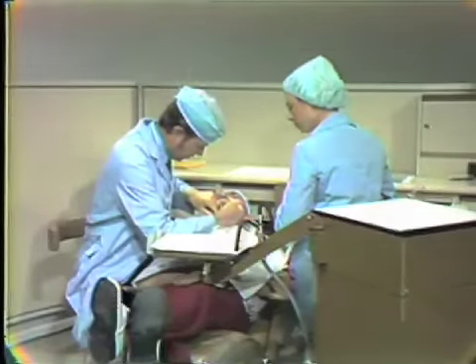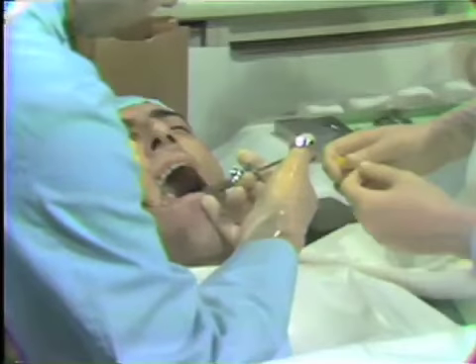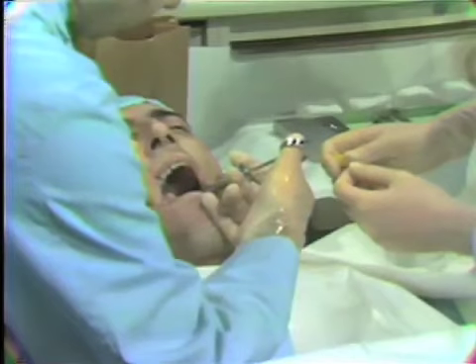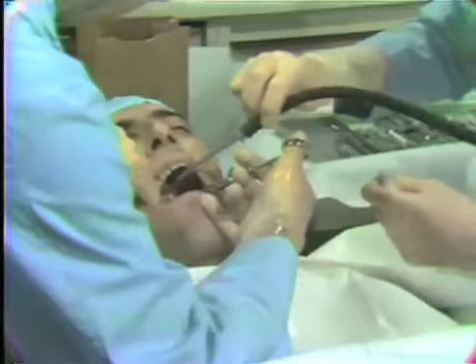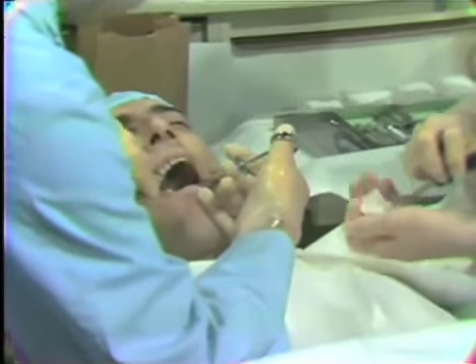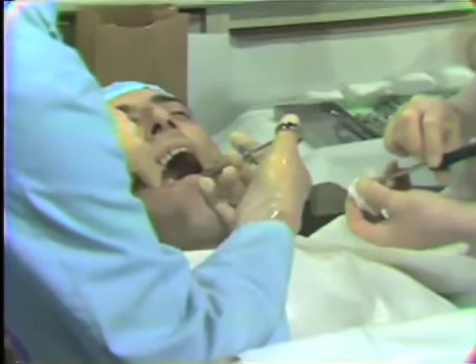You should be aware that the cubicle, the dental unit, and the chair have been cleaned, the instrument trays and necessary supplies are available, and the instruments are arranged in trays in the approximate order of their use. As instruments are used, they are returned to the original position on the tray so that they are readily available for reuse.